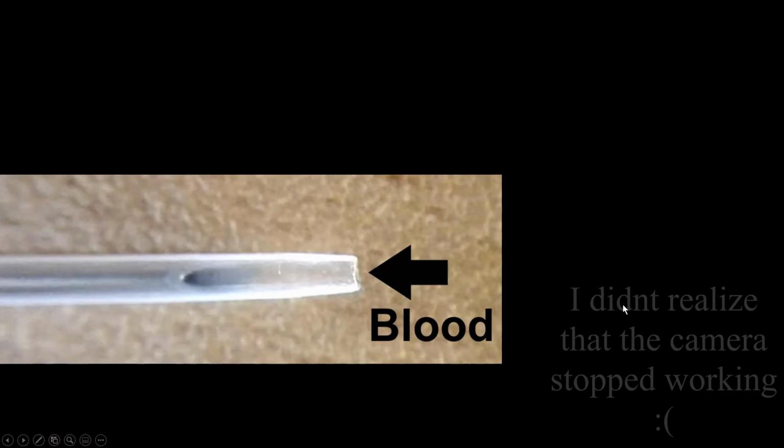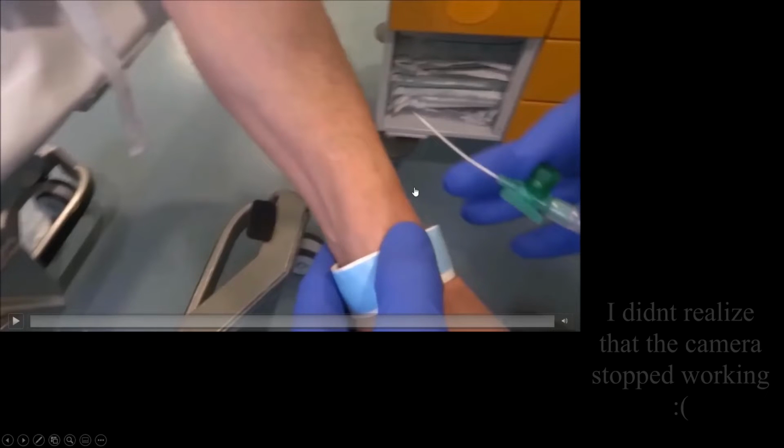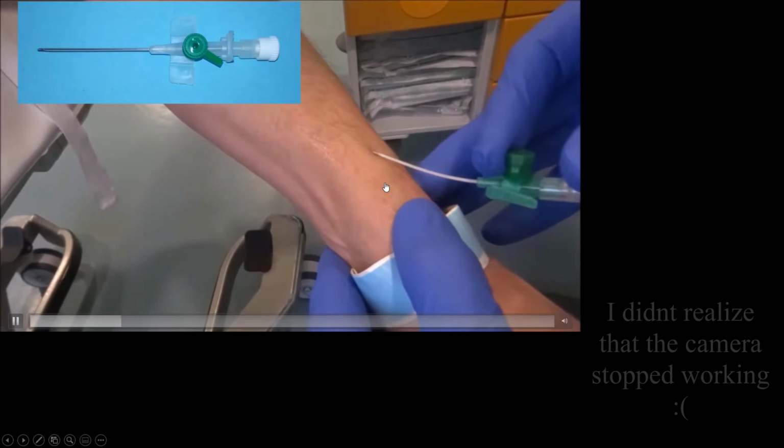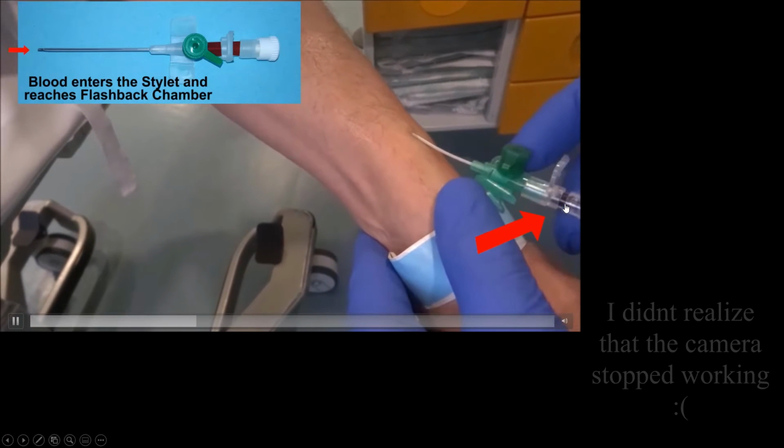I'll show you another video on this. Now in this you can see the cannula is being pushed inside the vein. You'll see one flashback in the flashback chamber, another one when the stylet is pulled back, and you see the flashback in the cannula. I'll play the video now. Now the cannula is being pushed inside, so the blood is being seen in the flashback chamber.